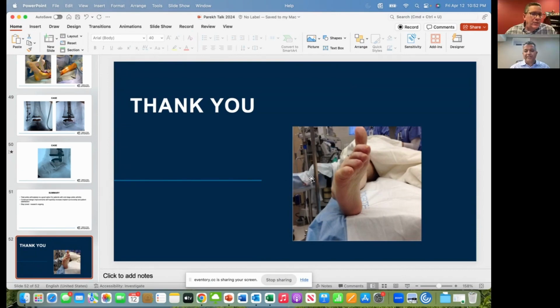There is. We're going to hear about this, I think, in talks coming up later in the program about 3D printing, and the custom 3D printed implants are certainly an exciting area of arthroplasty. As we start to treat these problems with the apex tibial component, to put a 3D printed or custom talus in, the talus needs to match the tibia. So you can 3D print the talus to match the apex tibial component or whatever tibial component you like using. I've done a handful of those, and I'm sure we'll hear more with more experience later on in our program.